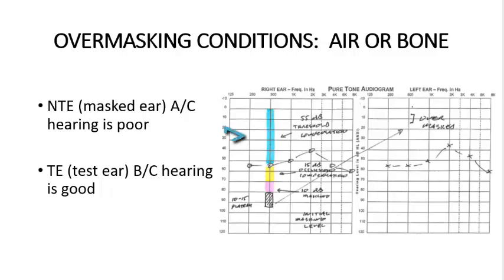We have the blue bar showing the masking noise must be as loud as the hearing threshold. They're at 500 Hertz. The yellow bar shows compensation for occlusion effect. The pink bar shows some active masking. In this case, it's 10 dB. And then the cross-hatched section shows potential increases in masking due to plateauing.